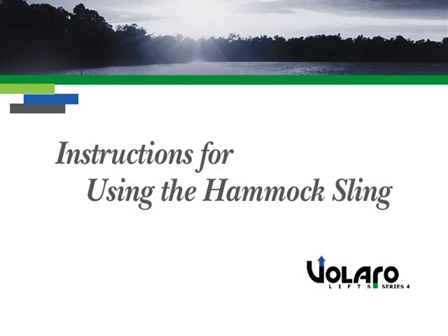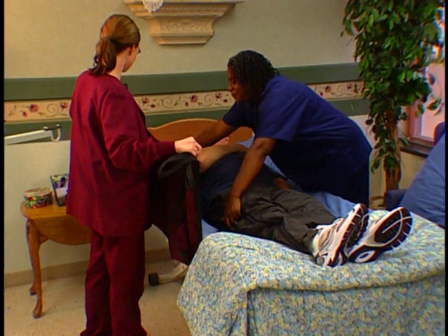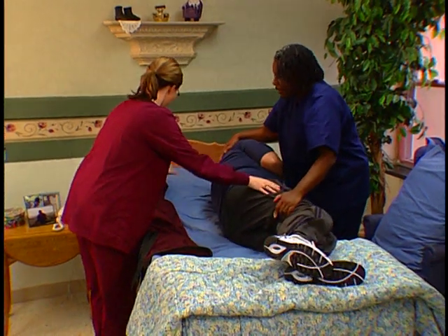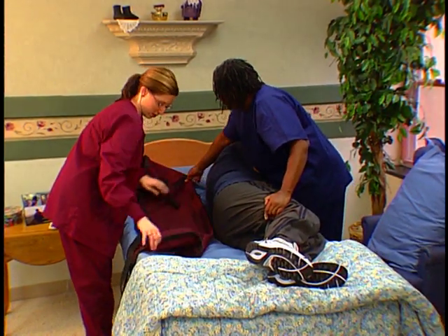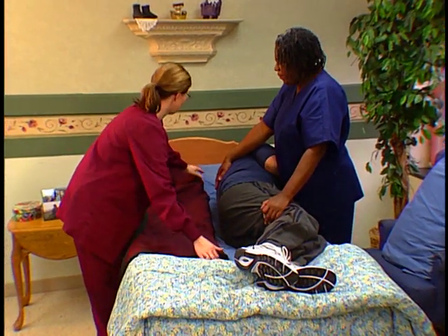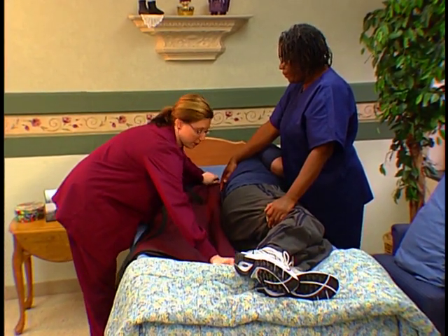Instructions for using the hammock sling. After completing your safety and sizing checks, fold the sling in half and roll the person on one side. Lay the folded sling along the backbone of the resident and overlap the top layer so it will be accessible when the resident rolls back.